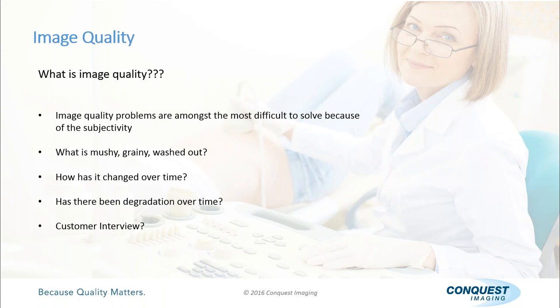Can they give you an example over time? Can you show me a patient 2 weeks ago versus one today that illustrates why the image quality has suffered in the last few weeks? And that brings you to the degradation over time. So how can you prove that? Well, you need to have real life situations that illustrate the good versus now what they call the bad.